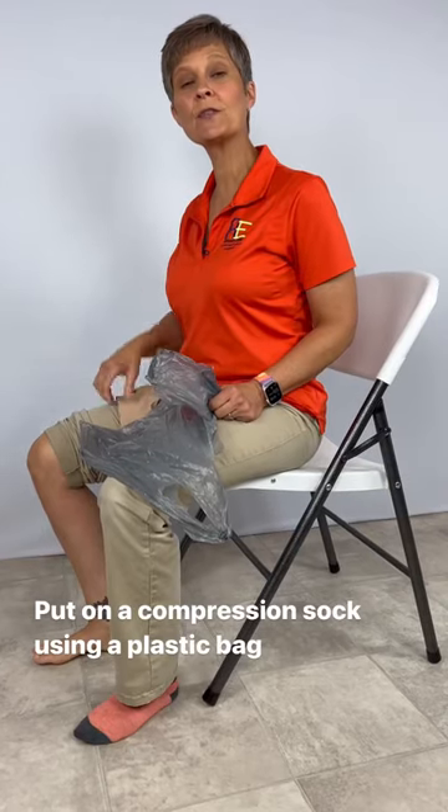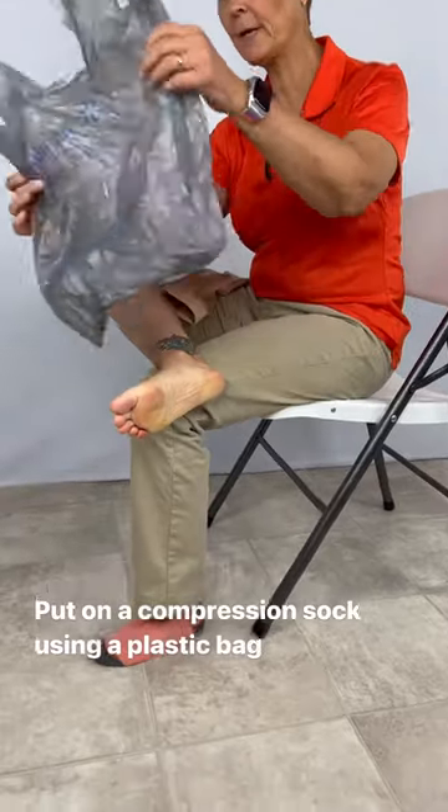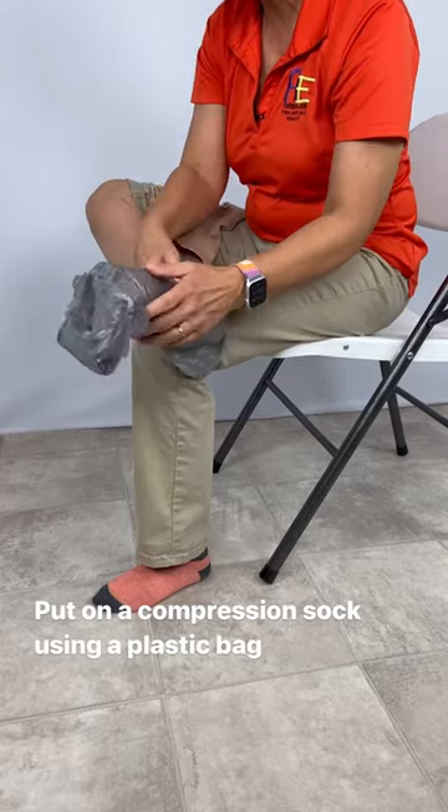Let's put on an open toe compression stocking with a plastic bag. So we're going to put my foot up like this. I'm going to stick the handles down this way, and I'm going to wrap this around my foot.